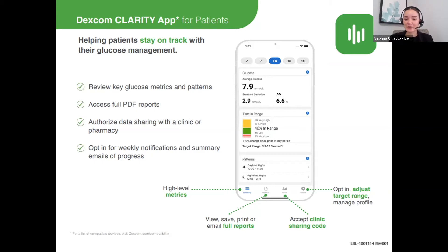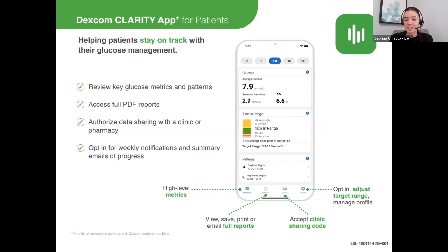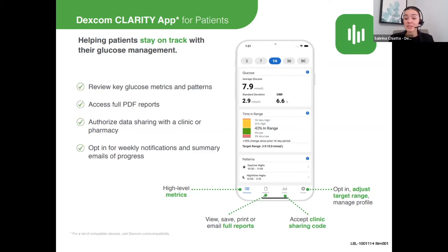There are many reports you can utilize, and even reports that pull out patterns. For example, if your patient experiences lows frequently between 2 and 3 a.m., this makes it really easy to utilize all the CGM data and bring the most value for your patients.